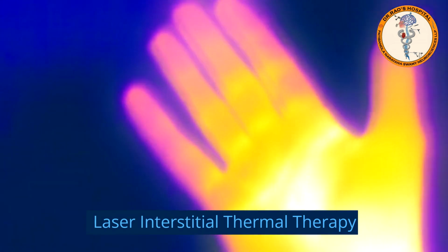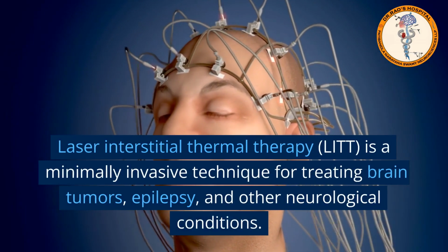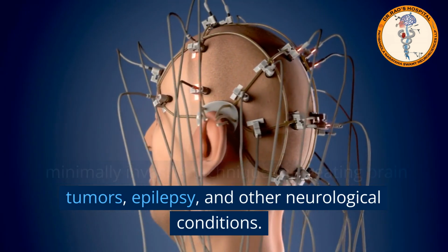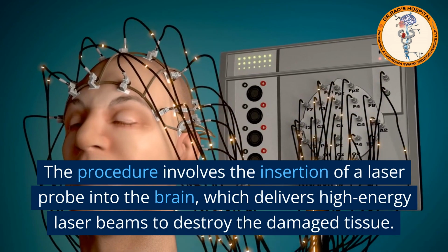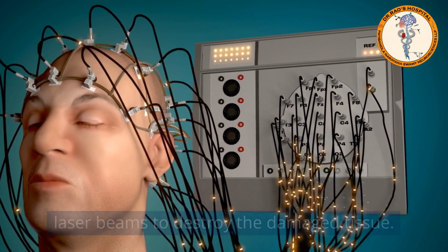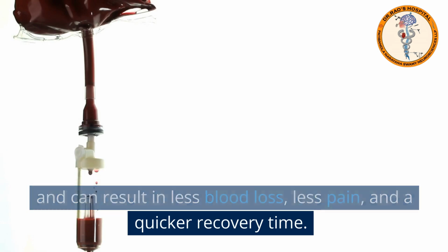Laser interstitial thermal therapy. Laser interstitial thermal therapy, LITT, is a minimally invasive technique for treating brain tumors, epilepsy, and other neurological conditions. The procedure involves the insertion of a laser probe into the brain, which delivers high-energy laser beams to destroy the damaged tissue. LITT is less invasive than traditional open surgery and can result in less blood loss, less pain, and a quicker recovery time.